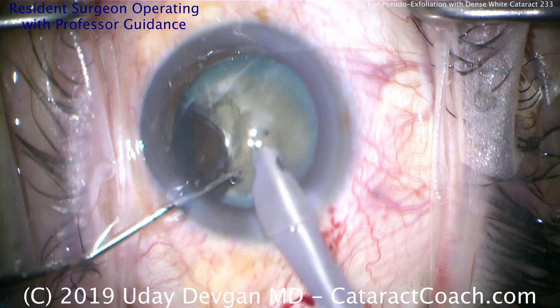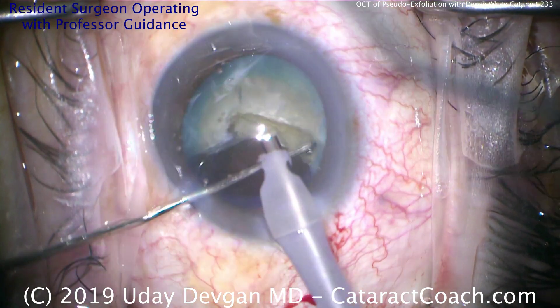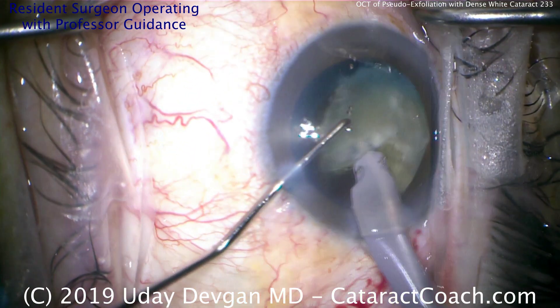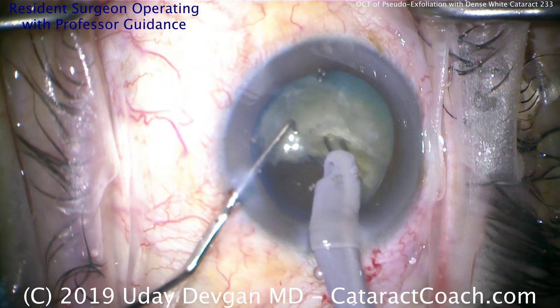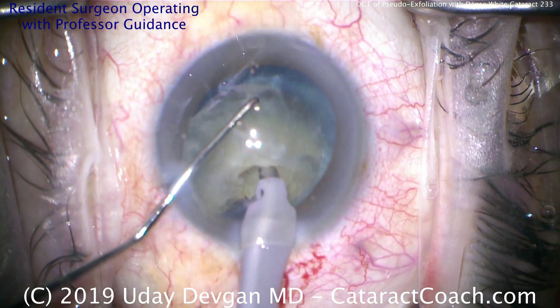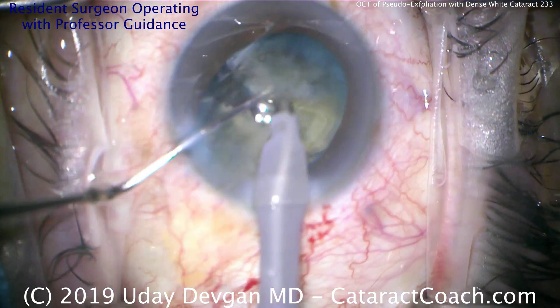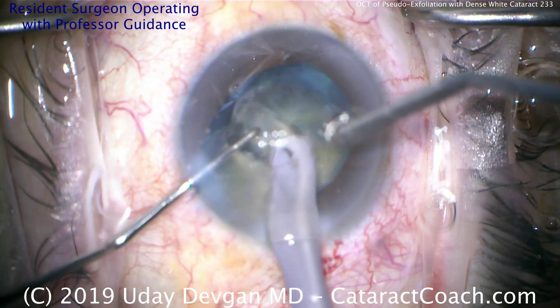Now that the first piece has been removed, there's a lot more working room in the capsule bag. The second half — the bigger piece — is remaining. Rotating that, then we're going to buzz into the nuclear piece. Bring it towards you and get the chopper around the equator. Buzz in more into the meaty part, advance the chopper, bring the piece towards you. You have to buzz the probe in and hold it before you can chop — if it's not buzzed in enough, try again. Now split it — there it is, beautiful. Split the nucleus into two pieces. Just slow and steady; do a few more sub-chops to bring the bulk into smaller pieces.